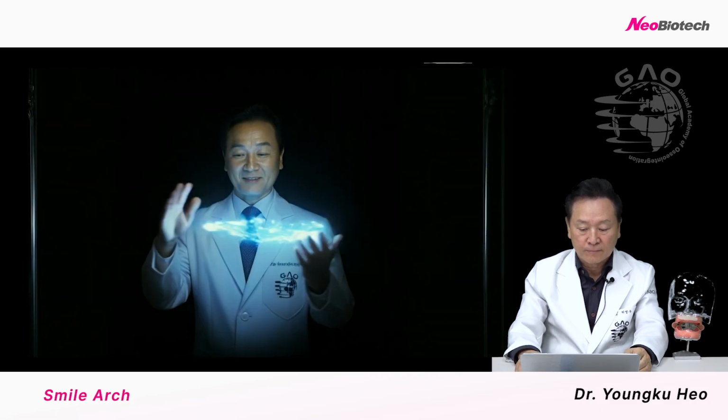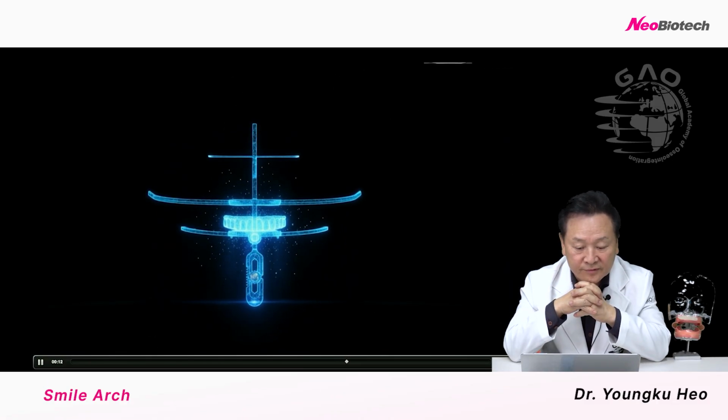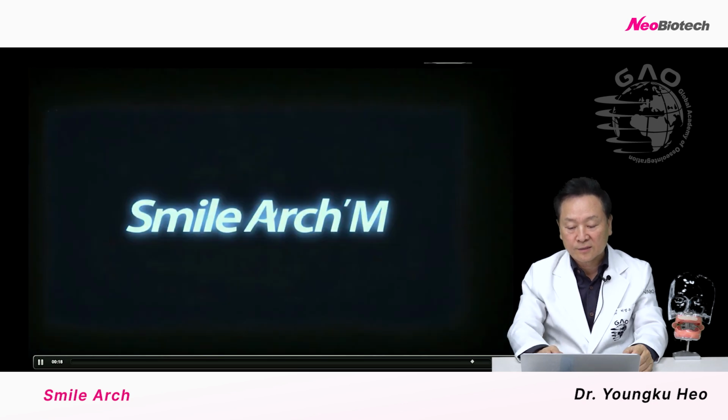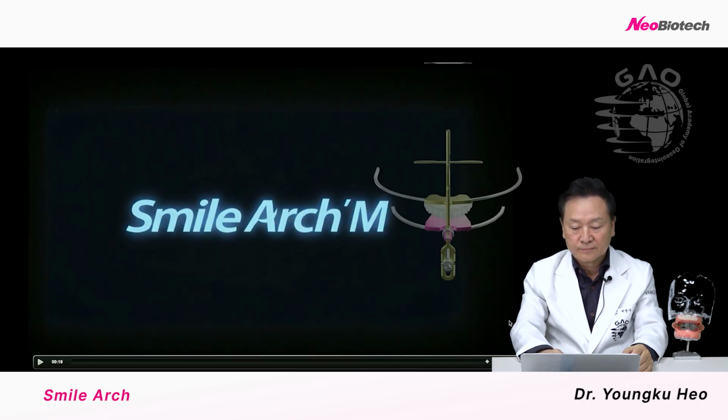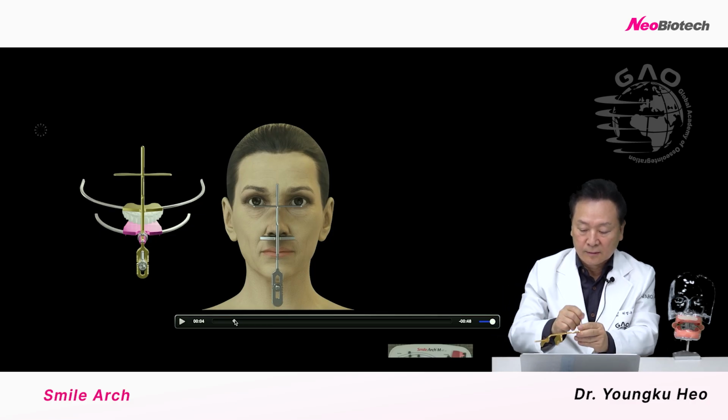So I made a very magic device to determine this information, called SmileArch M. It looks like this. First of all, using this device, we attach it to the face.